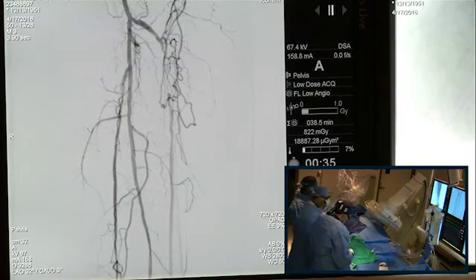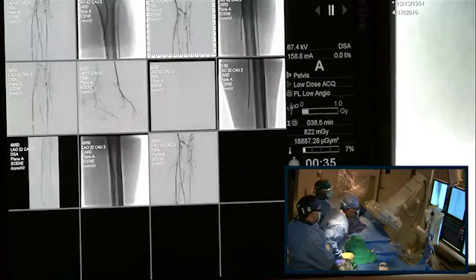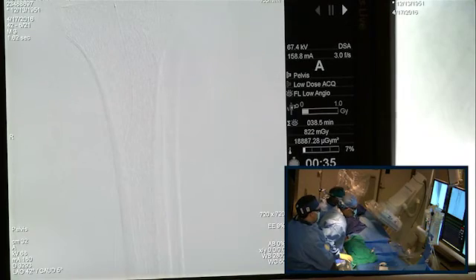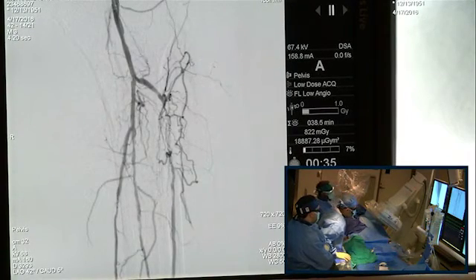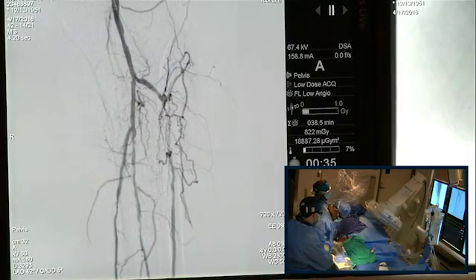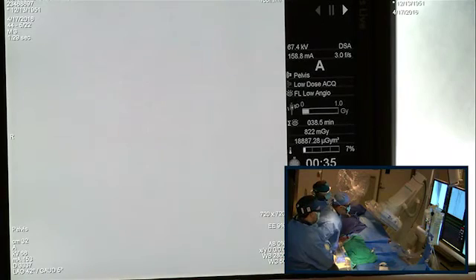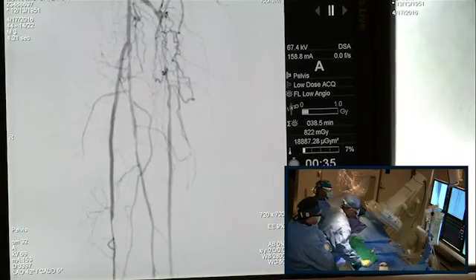Well, it's interesting because when we started earlier, you looked good. Yes, I think so. So when we did it earlier here, it looked good, but see that here? Yeah, it looked pretty good here. And now that we took out the wire and we went down the other branch, to be honest with you, my own feeling, I think that we need to, and look at here, here it looked beautiful.